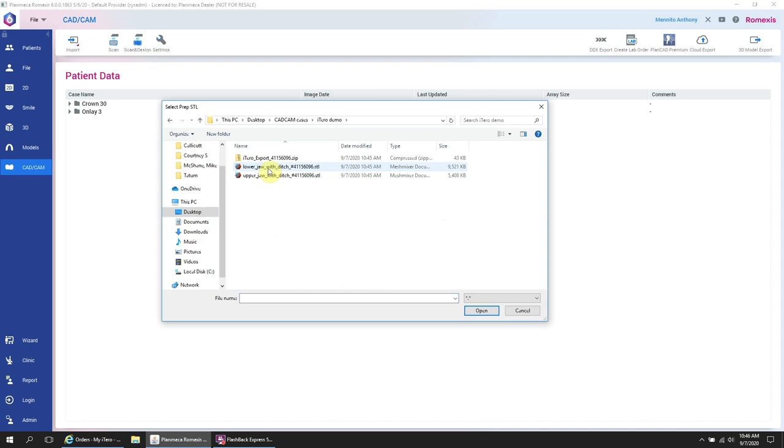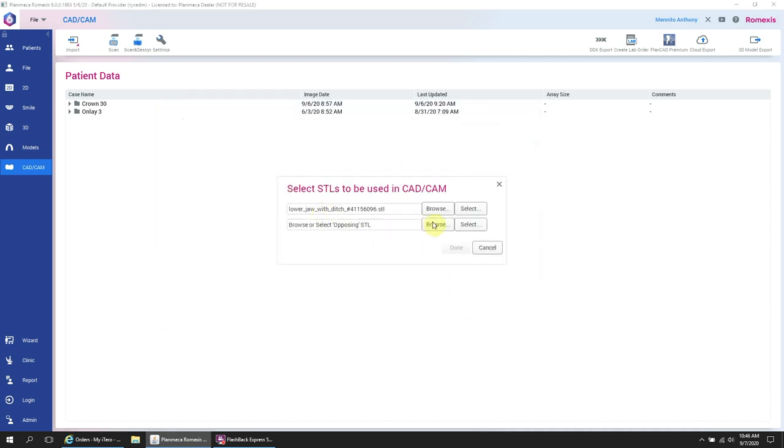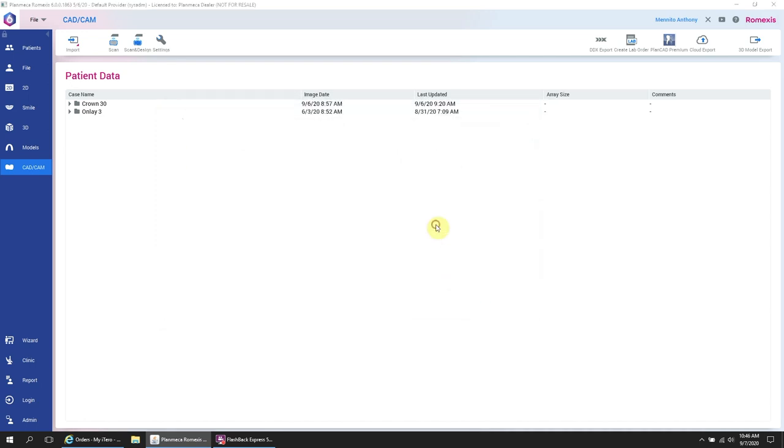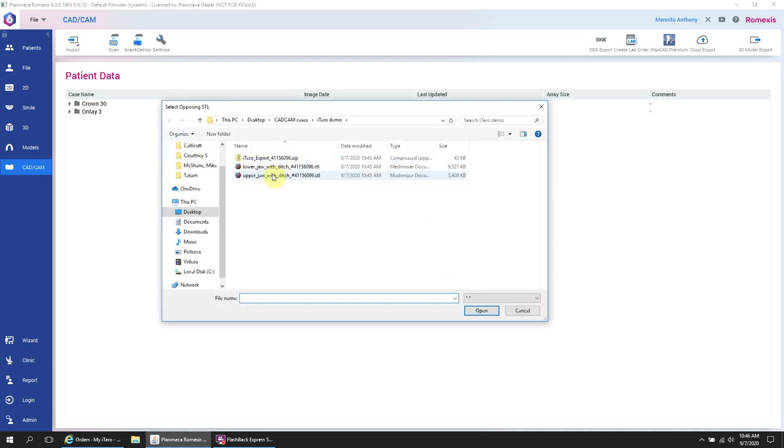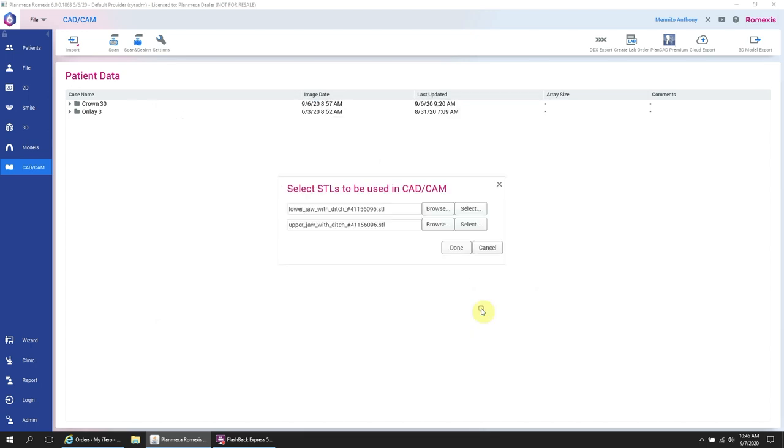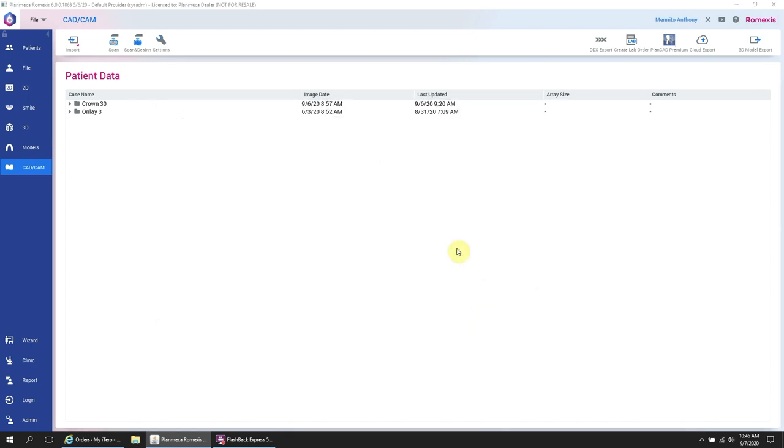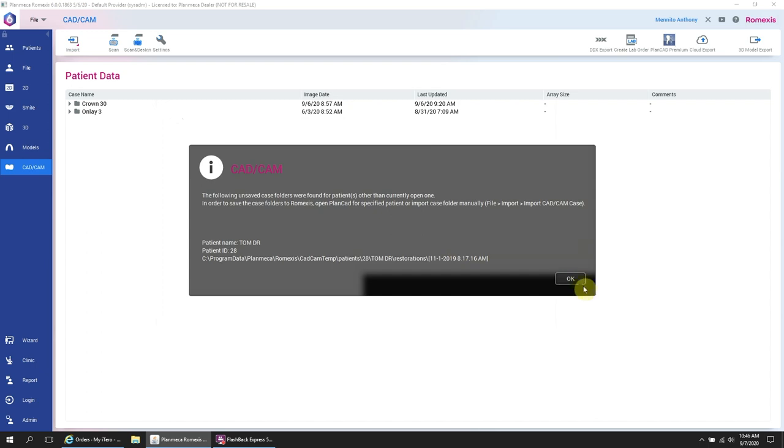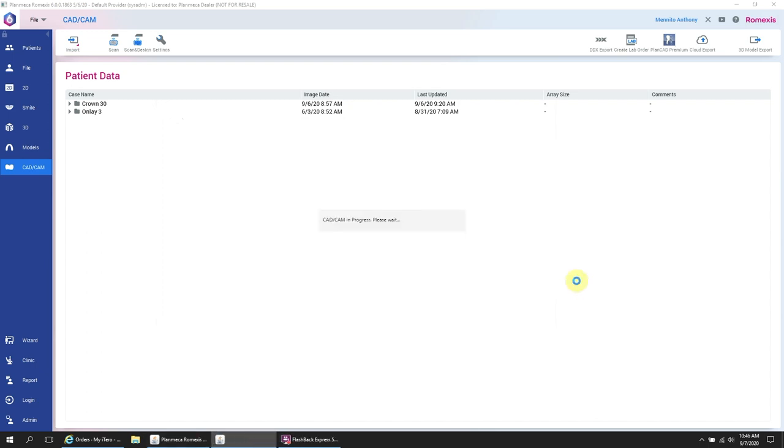So we're going to click on that first. And the opposing is the maxillary. So once we have those selected, we just hit done. And it will begin the process of opening those STLs to allow for our design work.